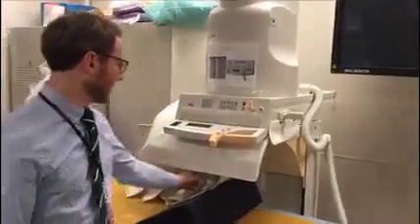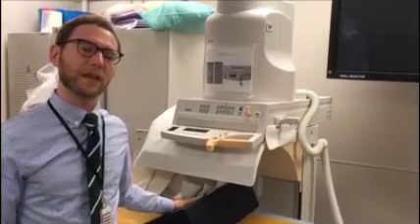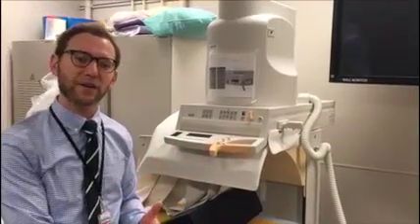The other things we can think about within the room itself are that the endoscopy screen and fluoroscopy screen could be together physically, and that's sort of an ergonomic principle that will help minimize our need to rotate our head and body, of the endoscopist and the rest of the team. And the table itself can have lead drapes. We'll point to more specifically in a moment. That's going to decrease scatter of the X-ray.